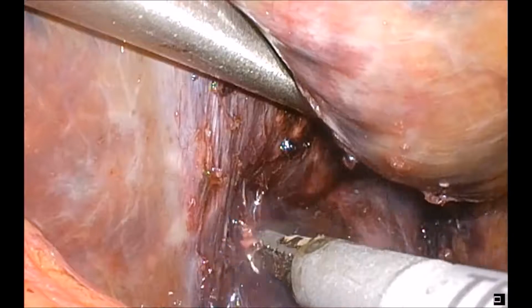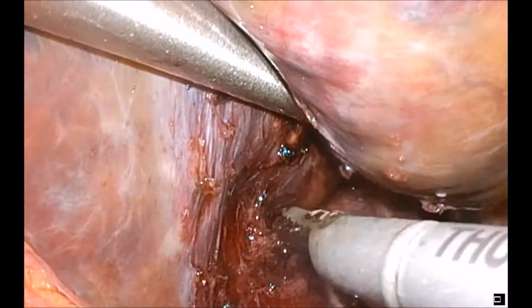The inferior vena cava is then dissected off the back of the caudate lobe there.